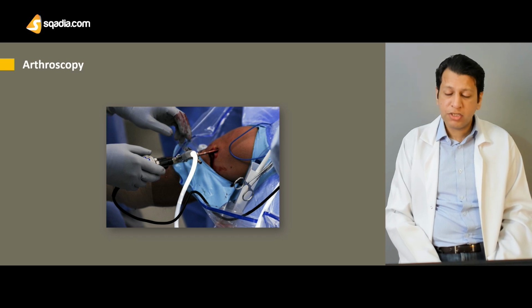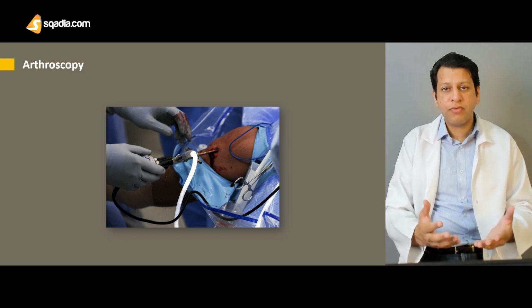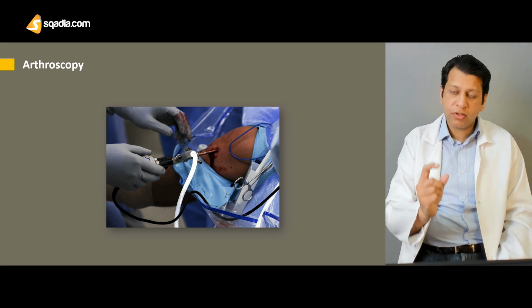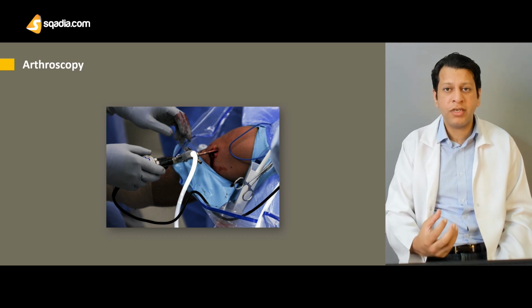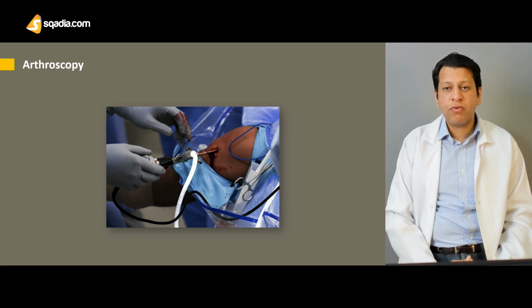It was a Japanese professor, Professor Kenji Takagi, who in 1918 modified this further into a 7.3 mm scope, which he used to view the inside of the knee joint, as well as for cystoscopy.